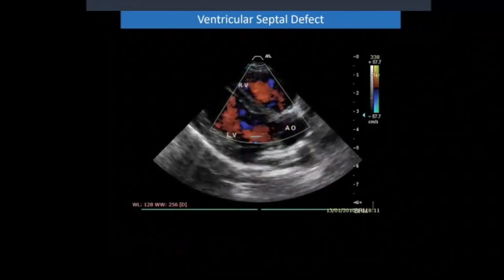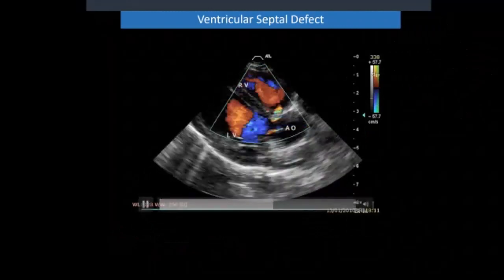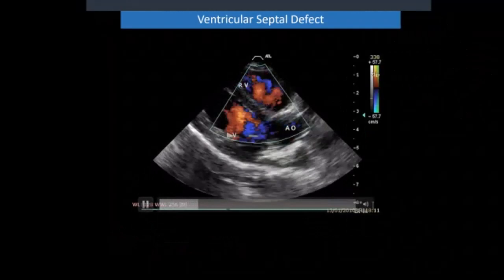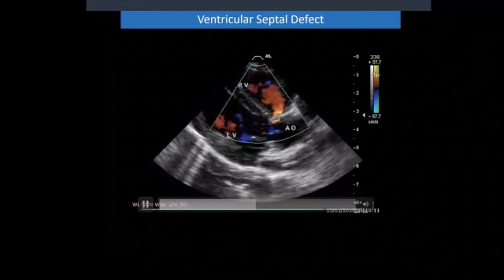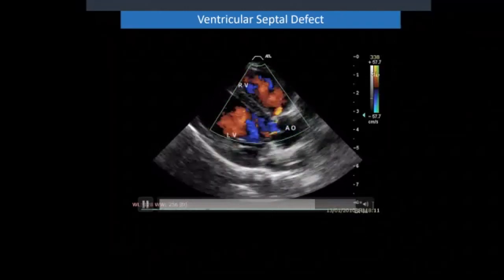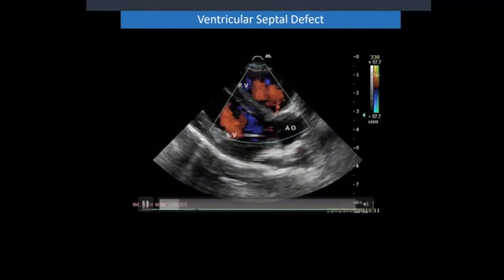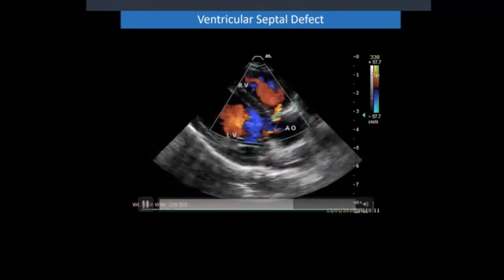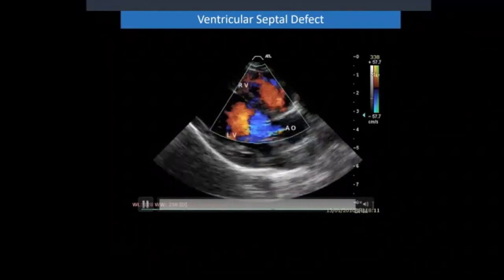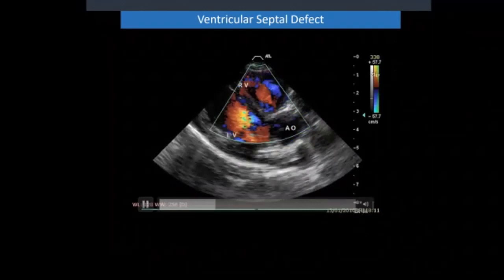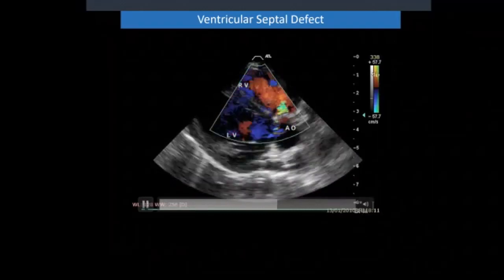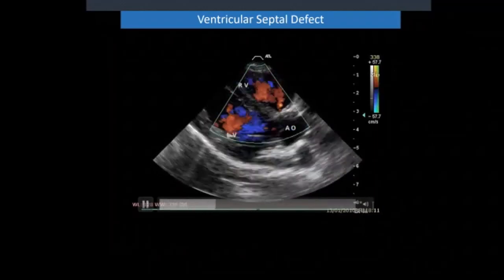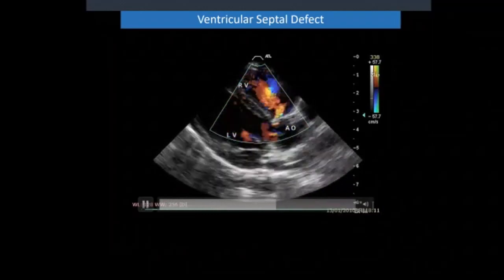Here's a ventricular septal defect on a right parasternal long axis view optimised for looking at the VSD — the hole in the heart. The VSD is high up in the septum. I can see flow heading towards the probe: in diastole it's red, in systole it's turbulent. You can also see some normal laminar flow through the aortic outflow, and if you look closely there is also some aortic insufficiency — a little blue jet from the aorta. So it's a VSD with some aortic insufficiency.